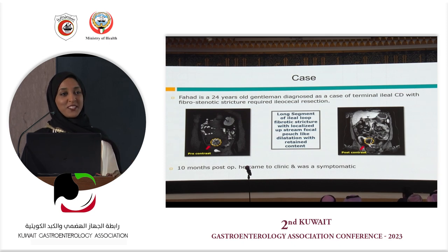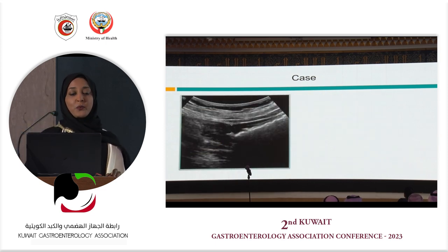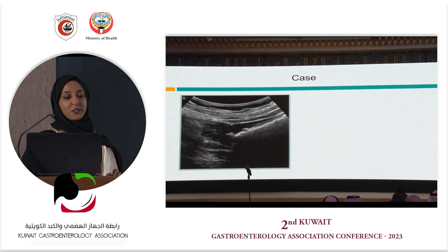After 10 months, he presented to the clinic. Out of the blue, he decided to come and show his face. He told me, well, doctor, I'm still doing well, I have no problem, but I just came to check on myself. I was quite worried, so we proceeded with intestinal ultrasound for this patient.